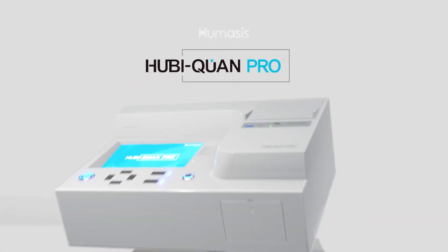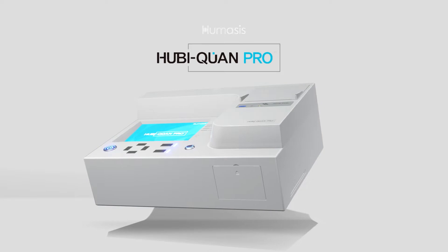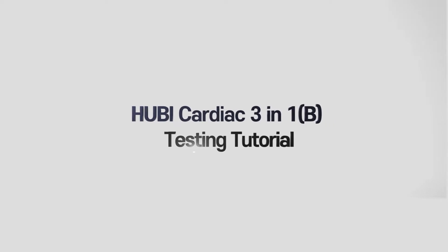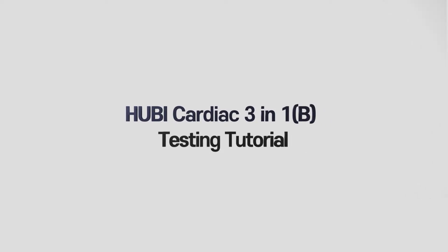A New Standard for the POCT Analyzer — Humasis HubiQuant Pro. Cardiac 3-in-1-B Testing Tutorial.